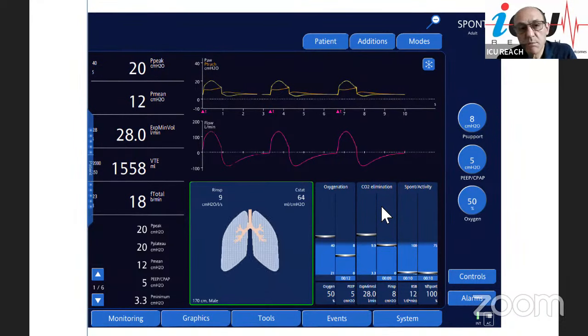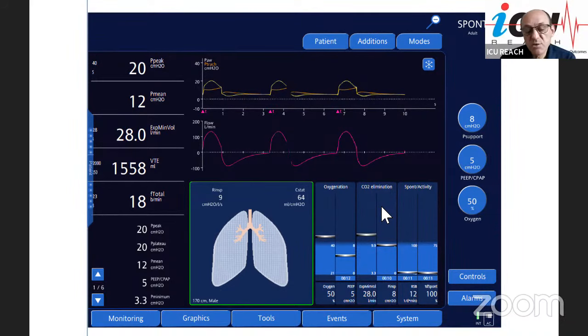And then the machine will measure the flow. So any increase in the resistance of the ET tube is due to external factors, such as what you mentioned, secretions, blood, or anything like this. The machine doesn't see it. And then the patient needs to exert extra effort in order to overcome that resistive load. That's a great question. Thank you very much. So frequent suctioning for those patients would still be required.